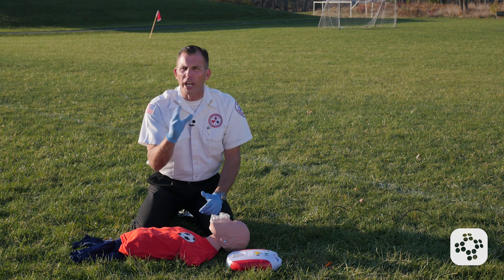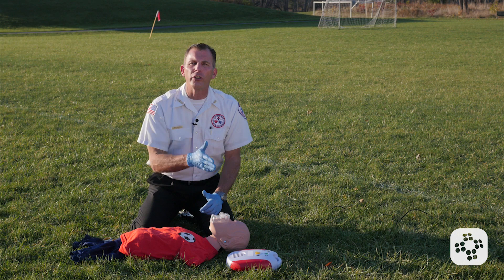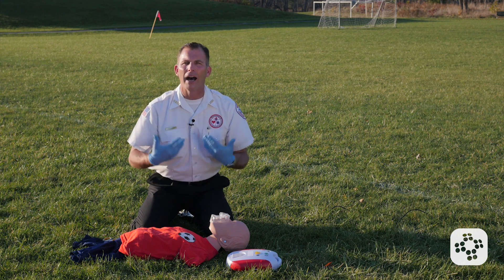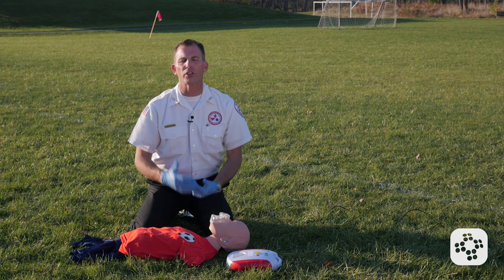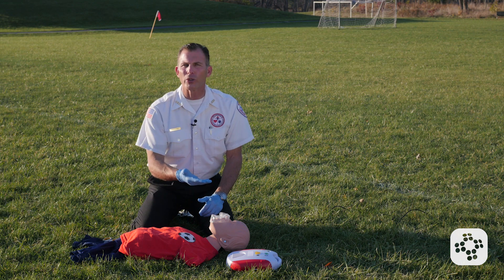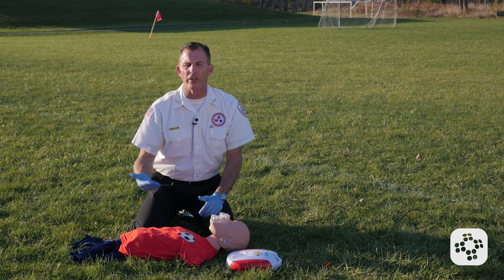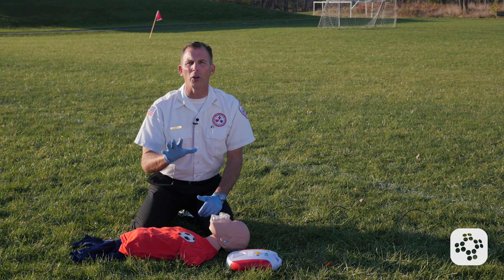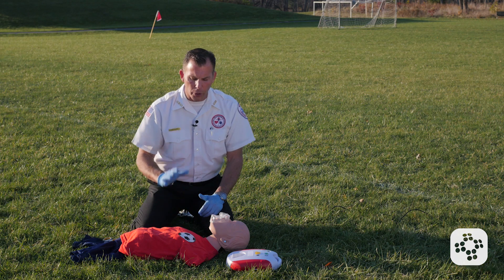The differentiation point is whether they're under or over 55 pounds. I know what you're thinking — you don't have a scale. We're just guessing. If you estimate they're less than 55 pounds, use the pediatric pads. If they're greater than that, the adult pads. If all you have is adult pads, you're going to use the adult pads on an infant, a child, and an adult. It's just fine.